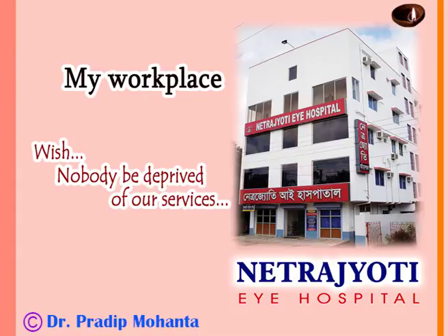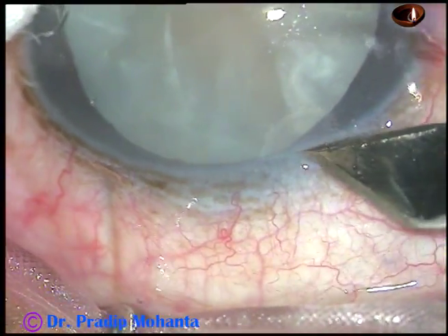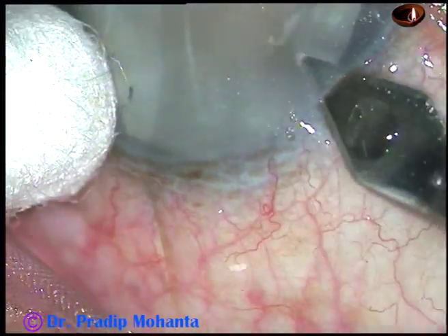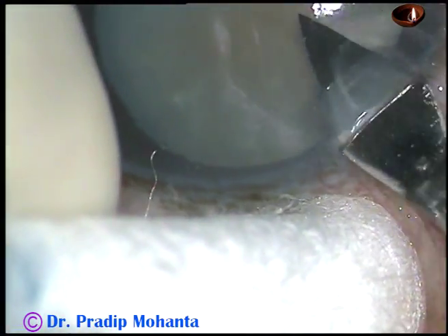Dear colleagues, welcome to my hospital at Rana Ghat, West Bengal, India. In this video, I want to show capsulorexis in two intumescent cataracts. This is the first one.